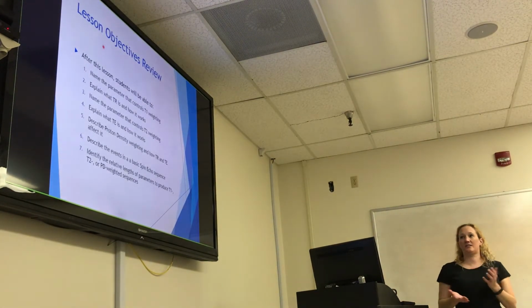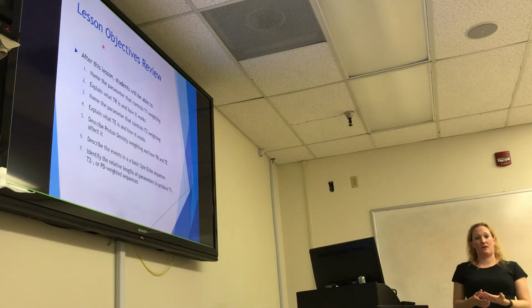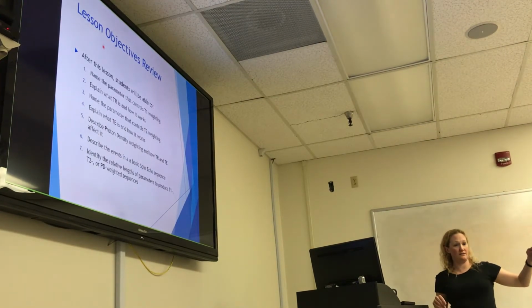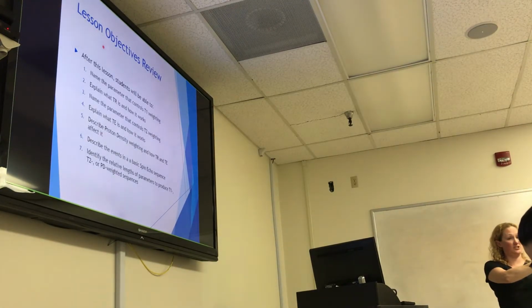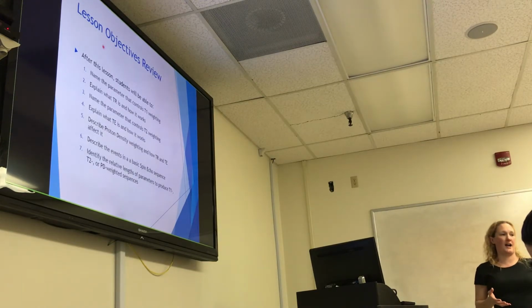let's review our objectives that we named at the beginning. So we named the parameter that controls our T1, and we now know that's TR. And we know that TR stands for repetition time. We also know that that means the time between exciting slice 1 and then going through all of our other slices and coming back to slice 1. That's our repetition time. We also now know that TE controls our T2 weighting and that TE is our echo time. So that's the time from when we excite our tissues to when we collect our echo or our signal, and we could also call it.